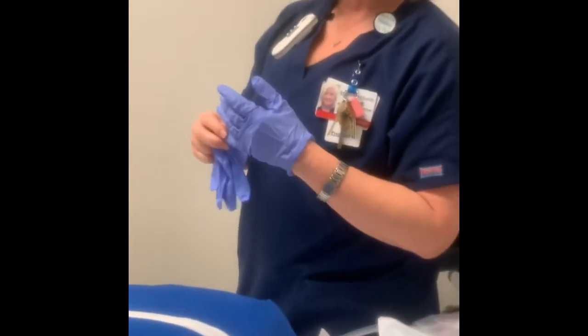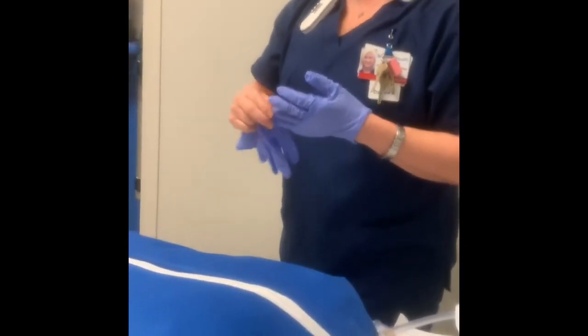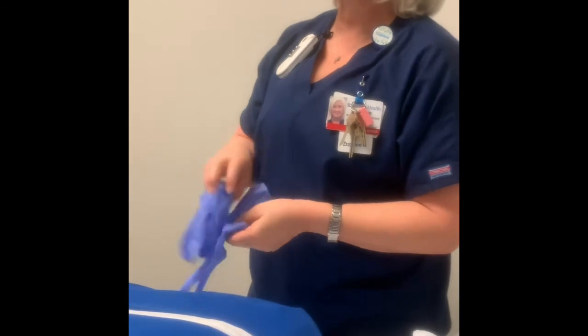And does the cap just prevent the air from coming out, and no worry about debris? No. Okay. So they probably want them to talk, but they have to leave the trach in because they may need to use it.